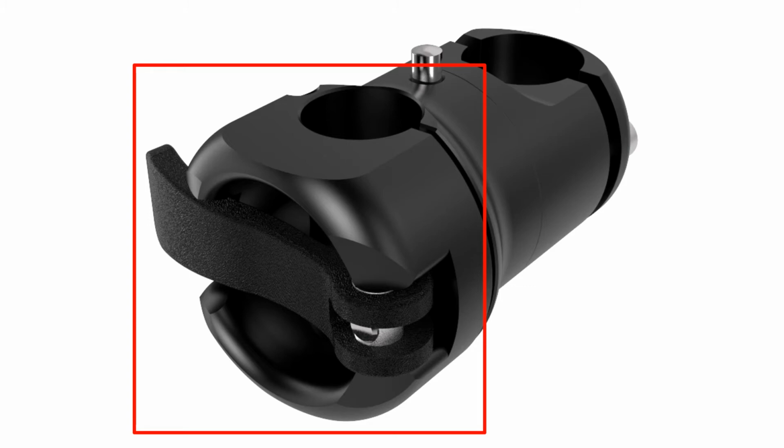These pieces also come in a variety of styles, but don't worry, the inner and outer pieces come together, so you only need to select one type of frame clamp. However, this is where we have the most trouble. If you order the wrong fastener or frame clamp, the mount won't work and you will have to make a second visit just to get the client the right clamp. So in order to get the right one first, we need to consider a few things. Let's start by taking a look at some more frame clamps on wheelchairs and try to understand the thinking process behind the choice of each frame clamp.